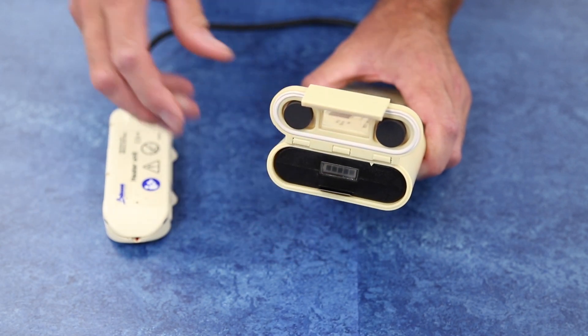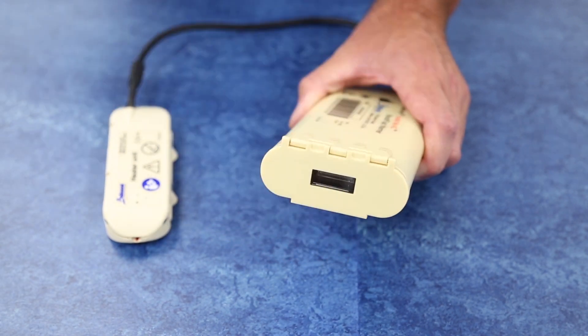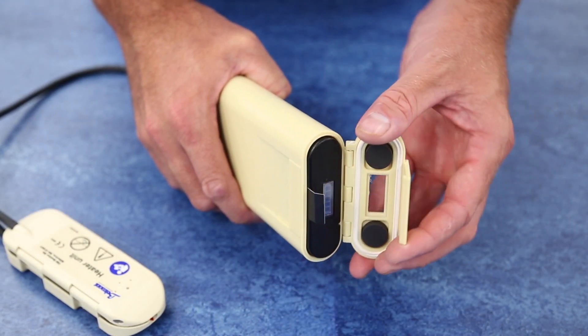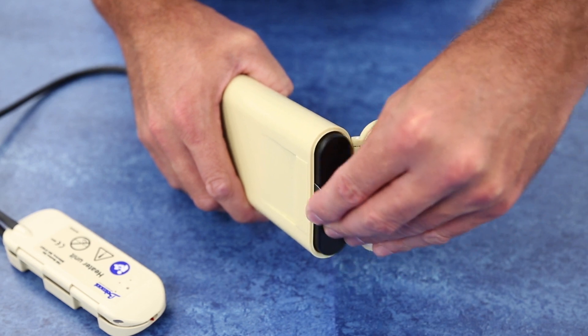Once the battery is seated, close and latch the door. If the door will not close or latch, be sure that the battery is fully seated in the correct position.